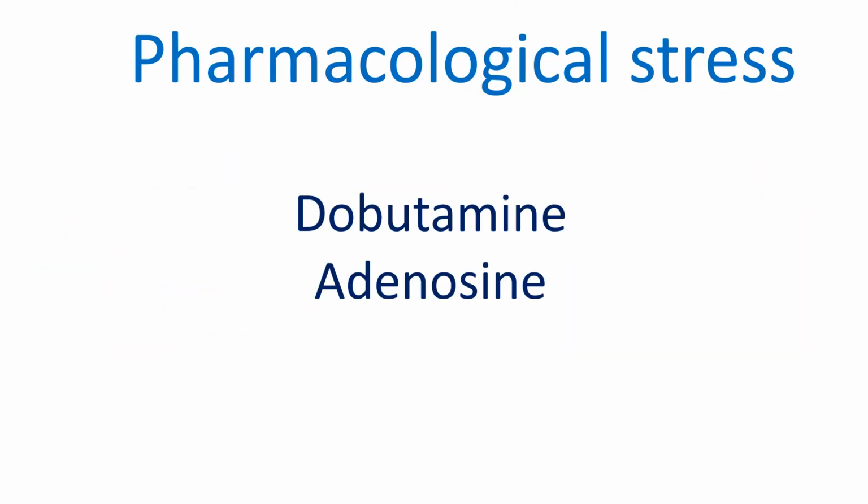Those who are unable to exercise on the treadmill may be given medications to stress the heart as injection or infusion, and stress nuclear images of the heart obtained as described above. Dobutamine and adenosine are two commonly used medications for this purpose.